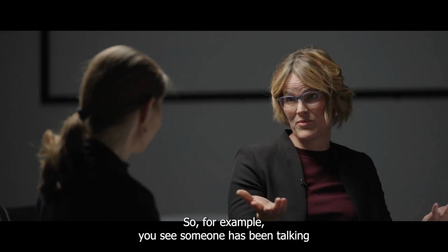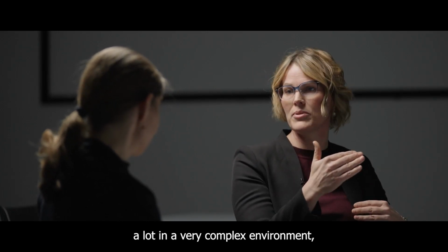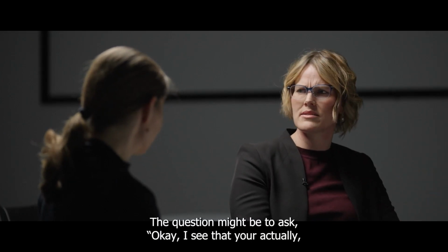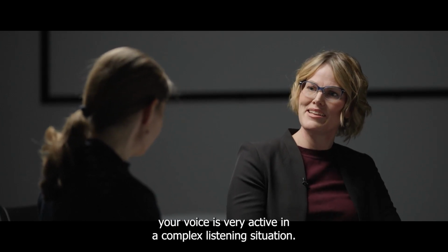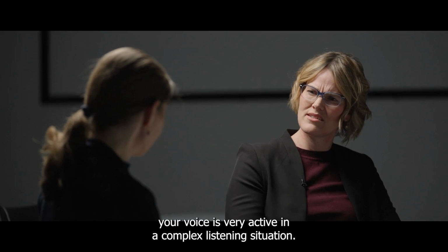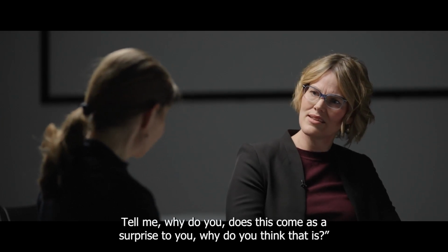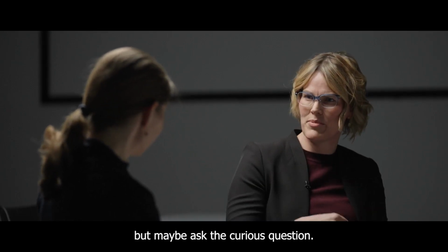So if, for example, you see someone has been talking a lot in a very complex environment right at the beginning of their journey with hearing aids, the question might be to ask, okay, I see that your voice is very active in a complex listening situation. Tell me, does this come as a surprise to you? Why do you think that is? So not trying to say to them, this is what's happening, but maybe ask the curious question.